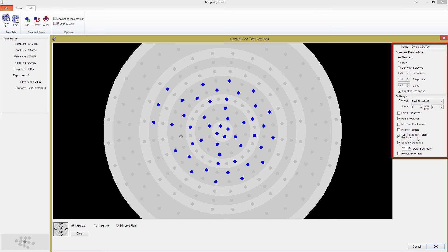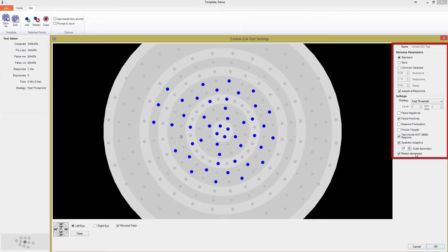At the very bottom, you can see the Retest Abnormals box. As the visual field test progresses, if the software notices a neighborhood of points which has a single depressed location, it marks it as abnormal. That point is then retested to ensure that the abnormal value is an actual localized defect rather than an artifact of patient error.